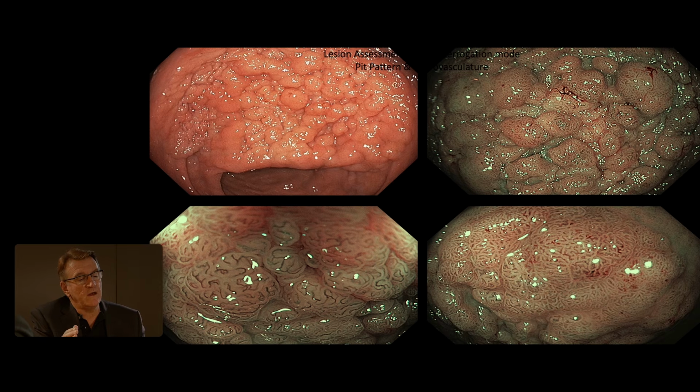We look at it in overview, and then we look with focal interrogation. So we become closer, we use near focus, and we examine the pit and microvascular pattern. Here you can see on this image that this is like a cerebrum. There are crypts that are branching, and this is a Kudo pit pattern type 4. But again, it's regular. If you were a psychedelic individual, you could have this as wallpaper in your bathroom. There's no derangement to the pattern, and the same with the vascular pattern.